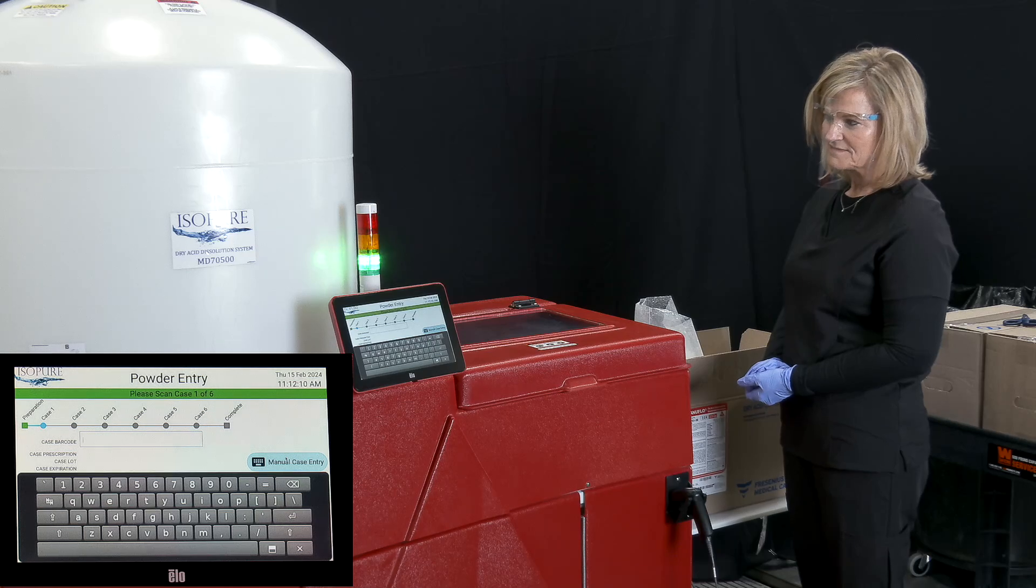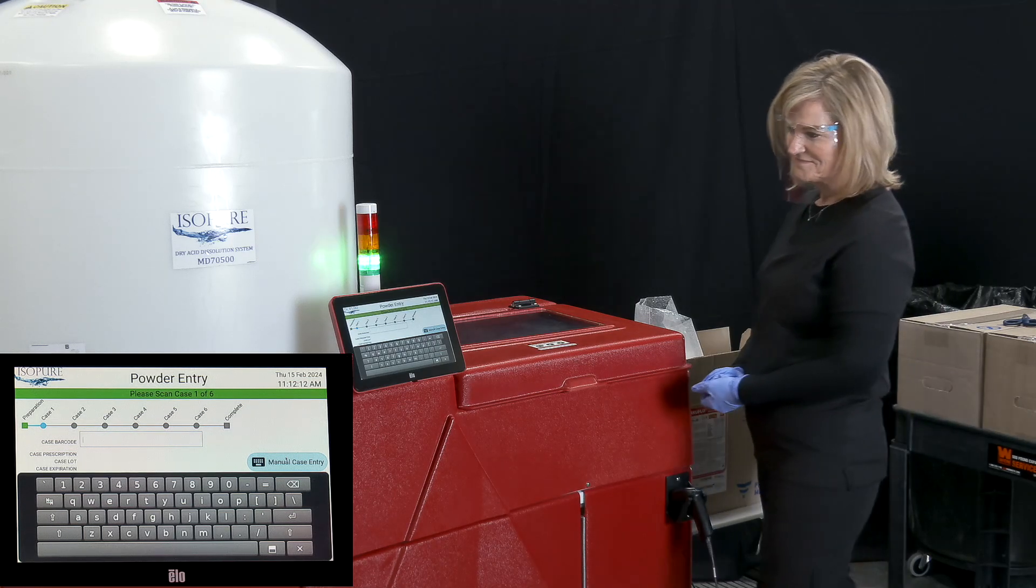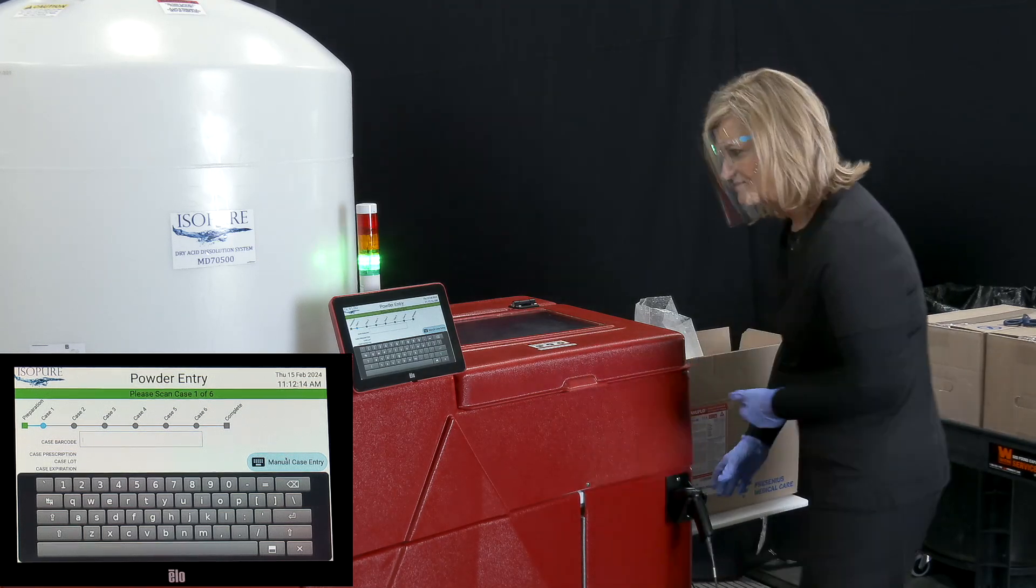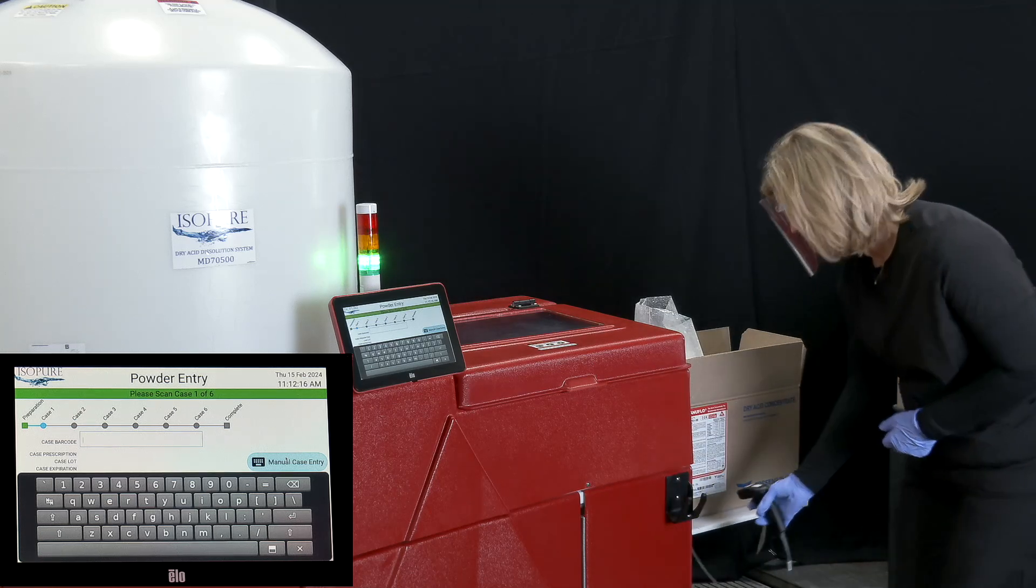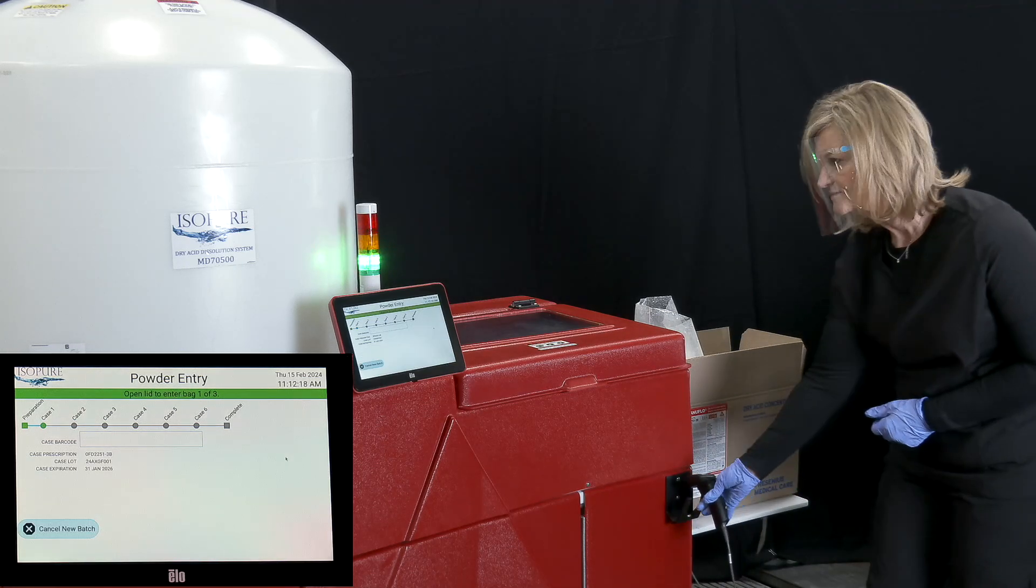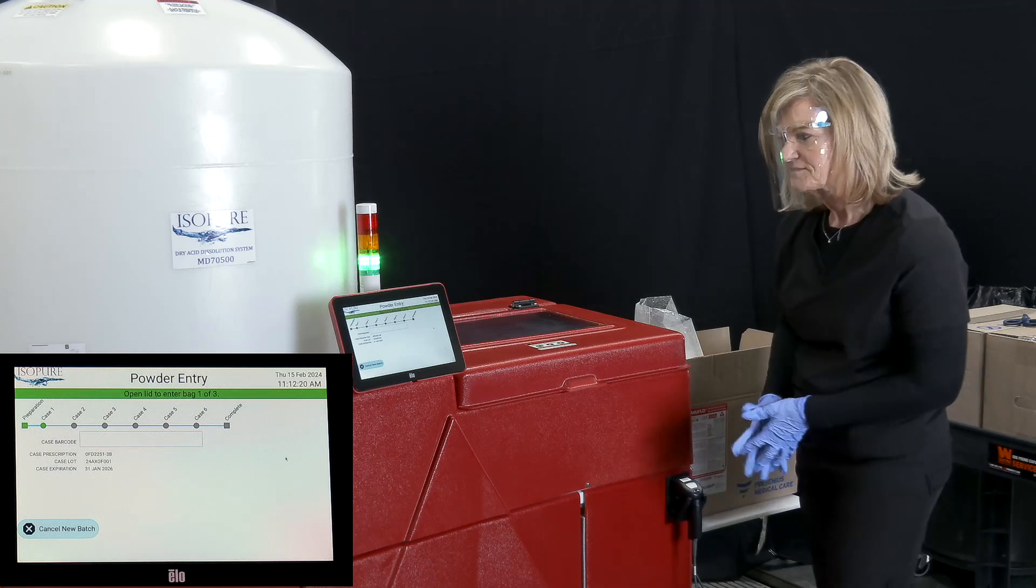To begin, place two cases on the shelf with labels facing out so that you can scan them. Use the barcode scanner to scan the QR code on the first case of dry acid concentrate.